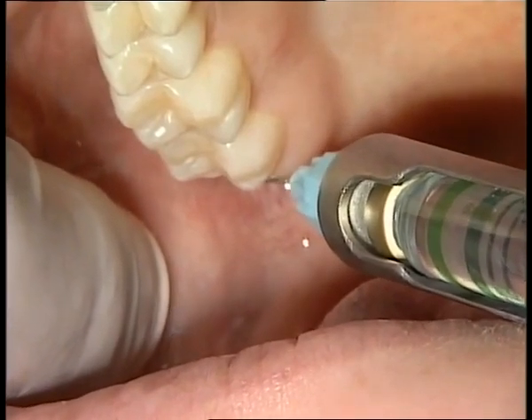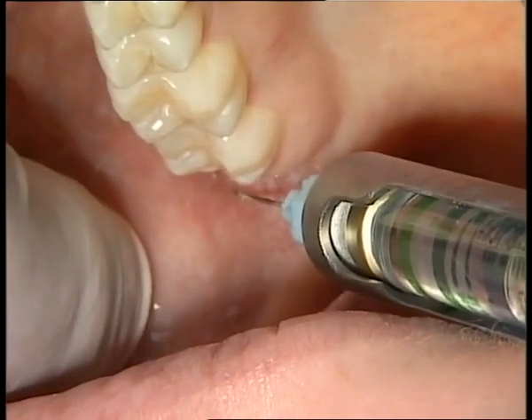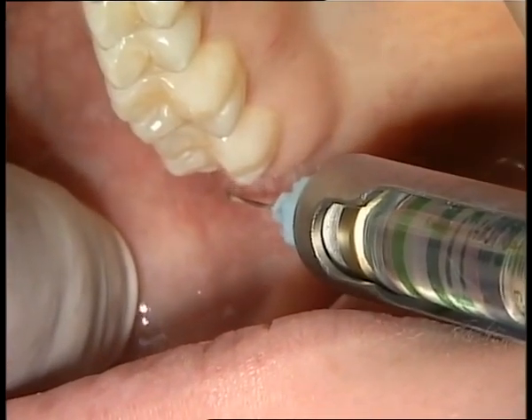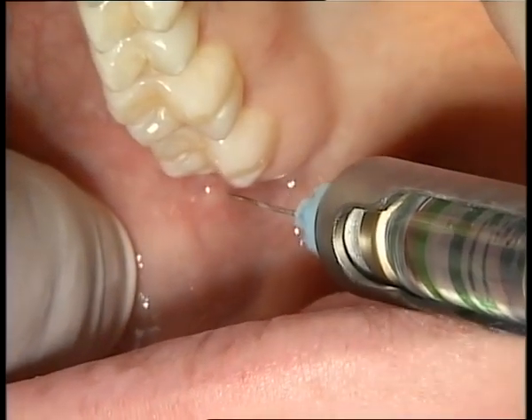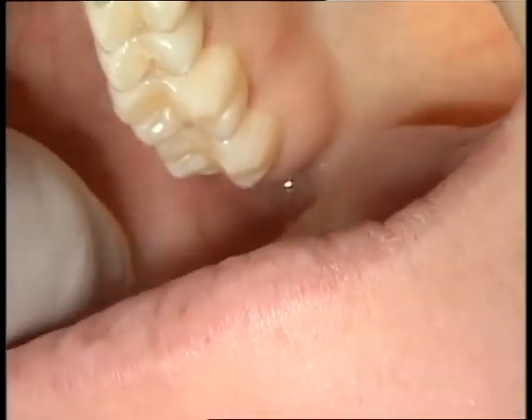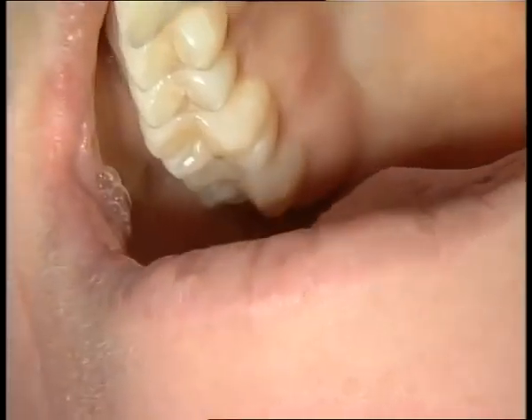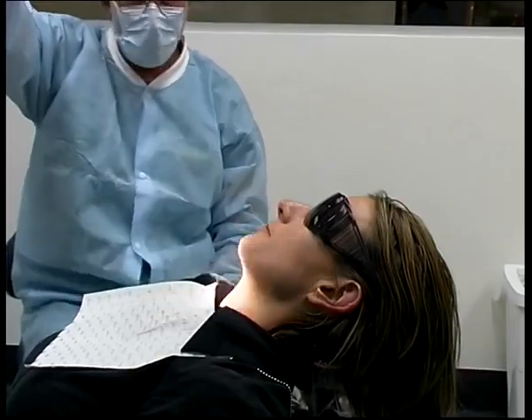Following 2 negative aspirations, a volume of 2.2 mL of local anesthetic is deposited slowly. At the completion of the injection, the patient is asked to keep their mouth open for 2 minutes and is positioned comfortably. Once the doctor learns the Gow-Gates technique, its success rate exceeds 95%, much higher than the inferior alveolar nerve block.